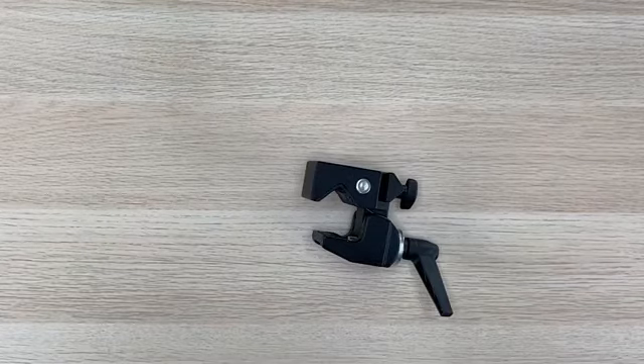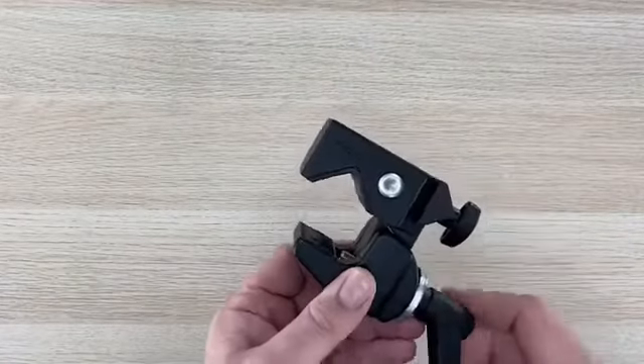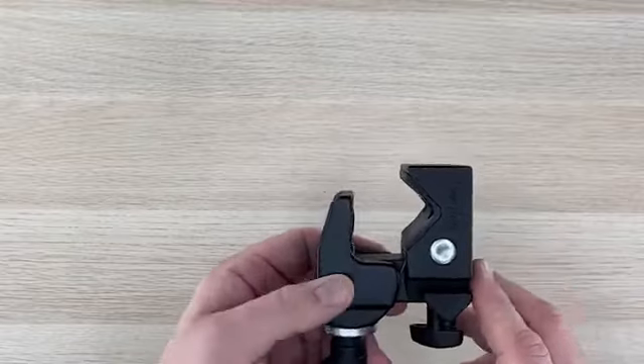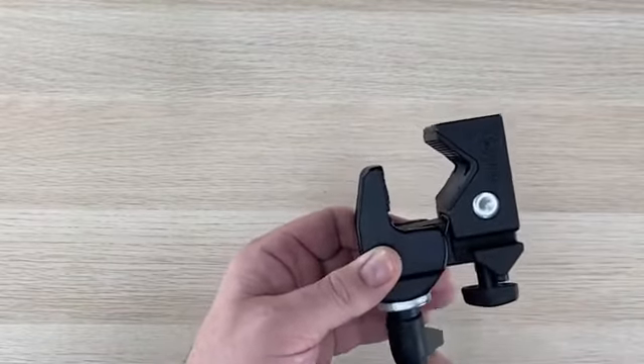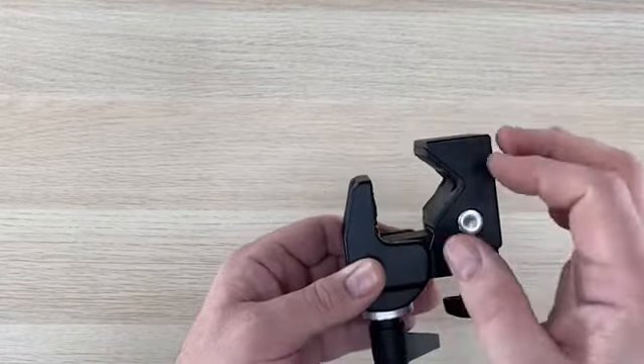Today I'm going to give you a quick overview of the super clamp that goes with our mounting systems. The orientation that the super clamp is in right now is an open seat, which will allow the clamp to be used for a wheelchair or other device that has a circular or oval shape.